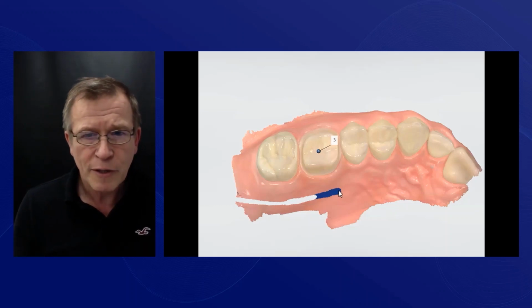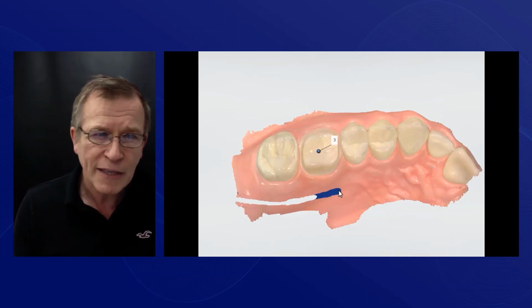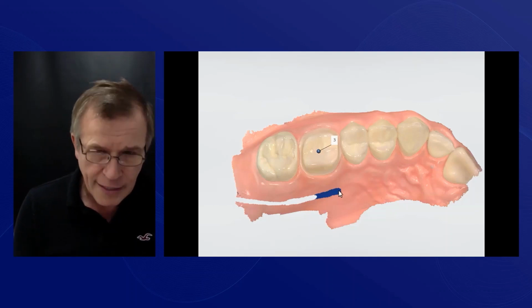So, but you can see where those margins are, and whether you're making the crown or sharing that with the technician, that's going to make our lives so much better. So let's look and see how this comes together, looking at patients.